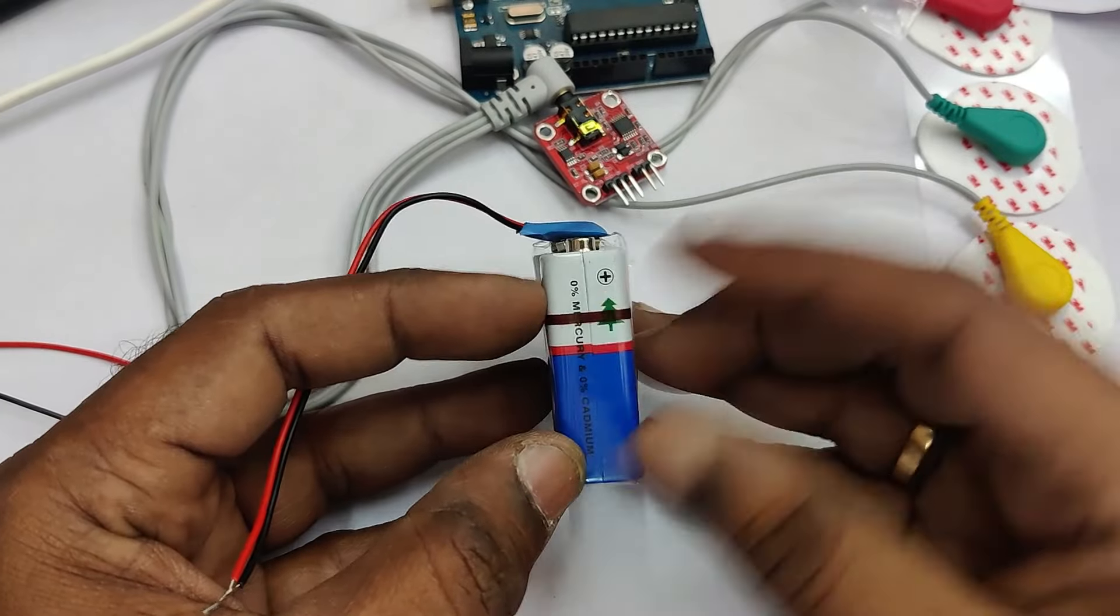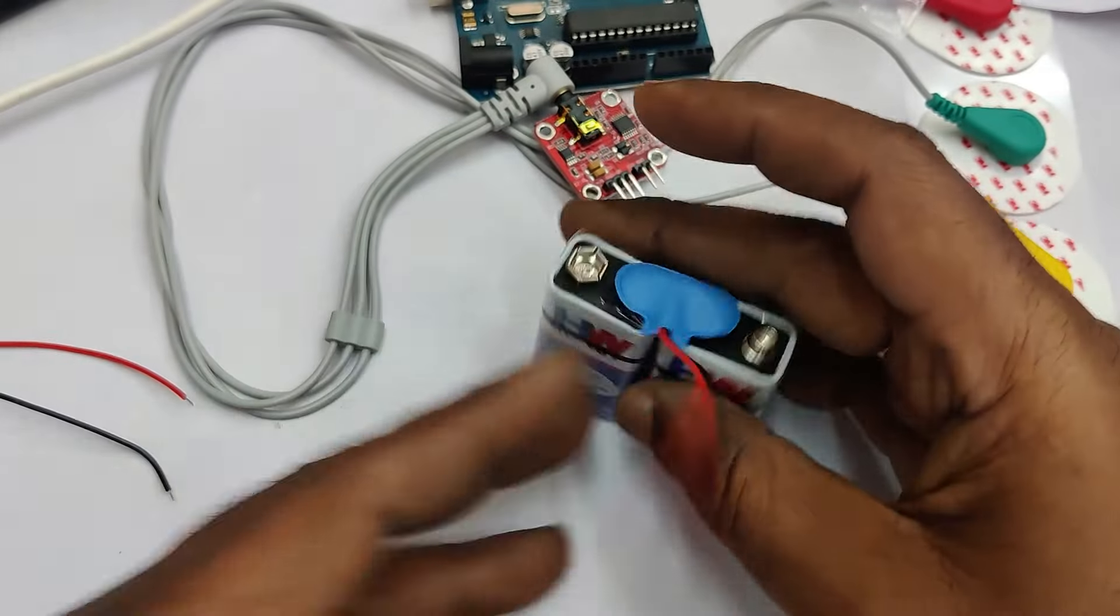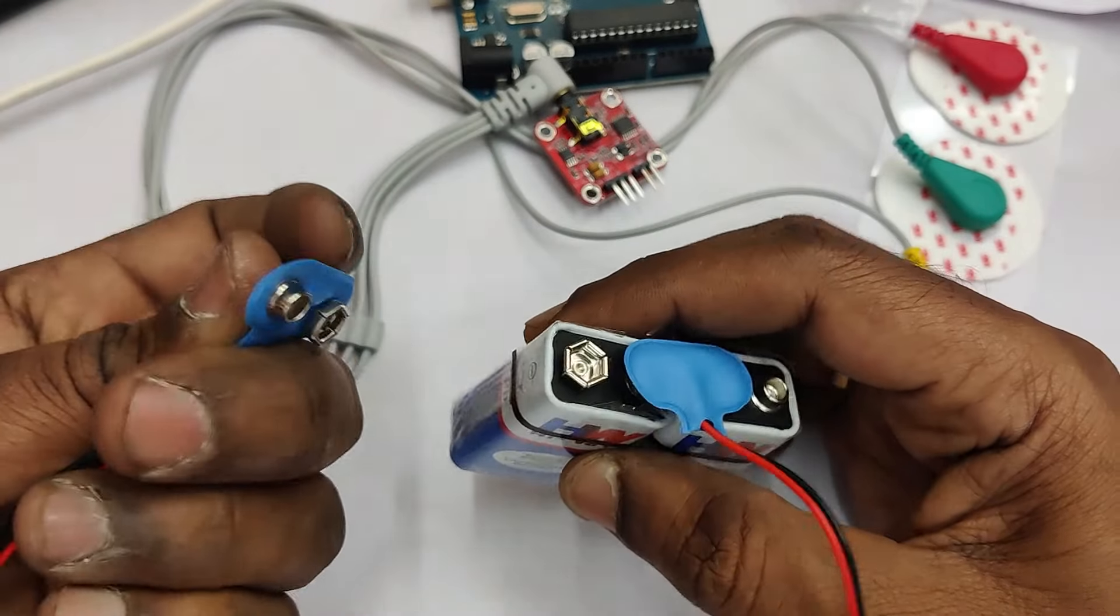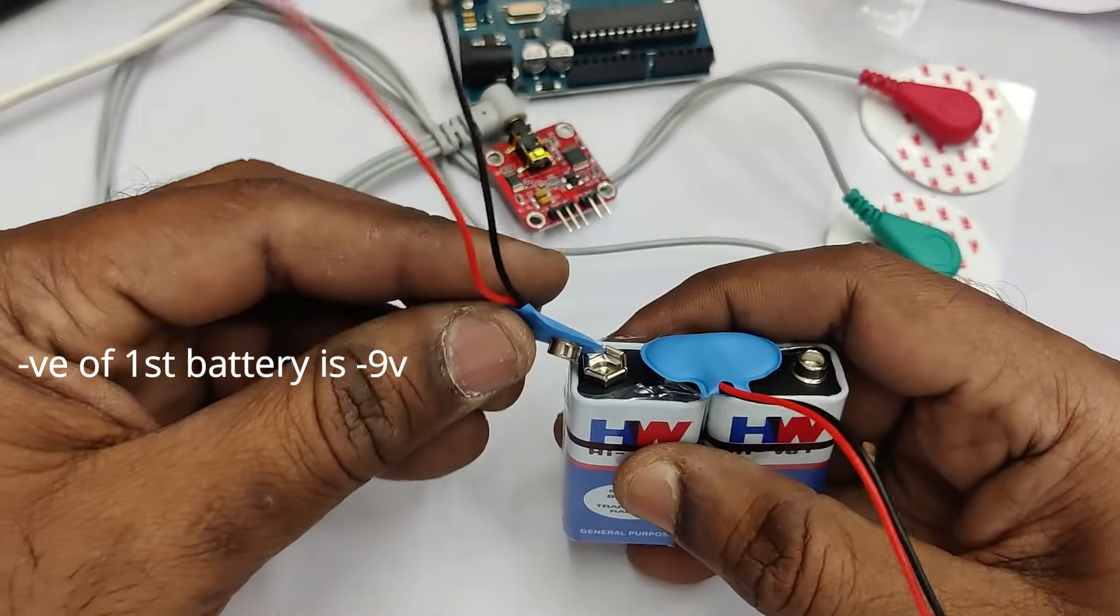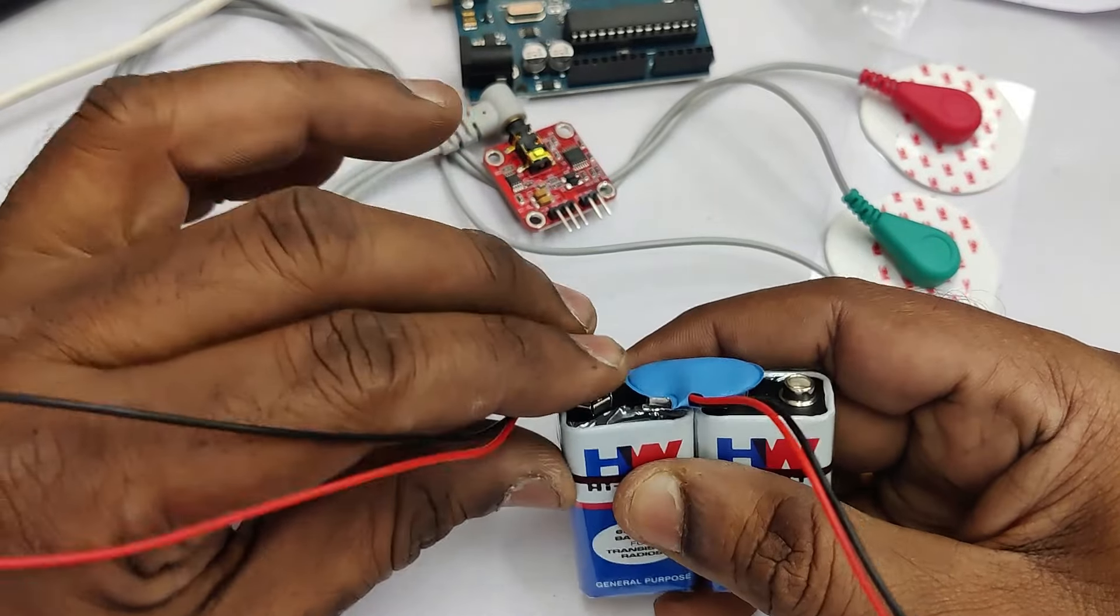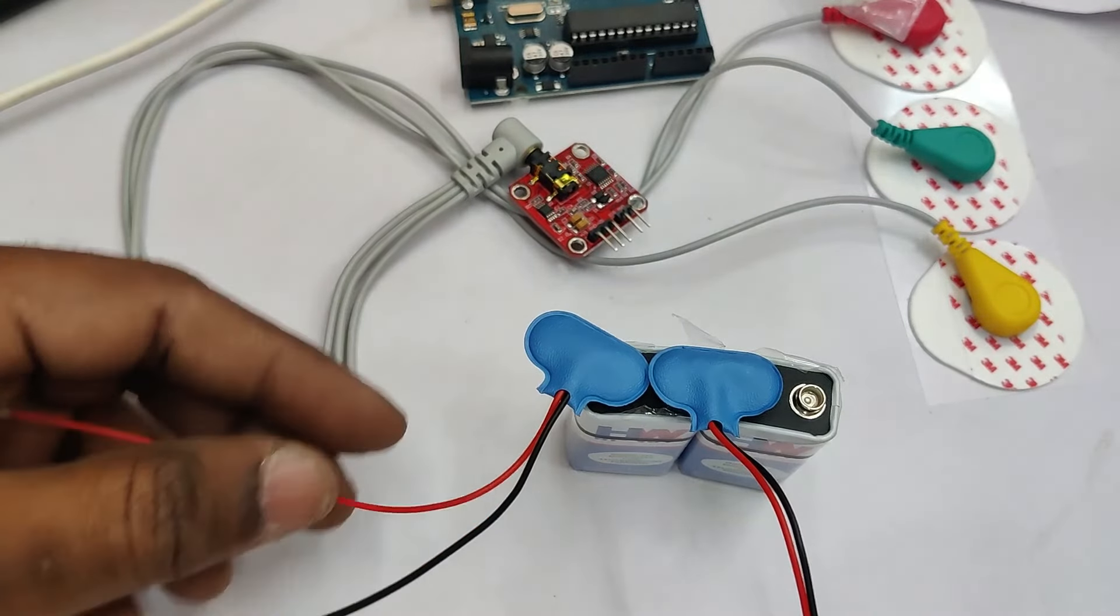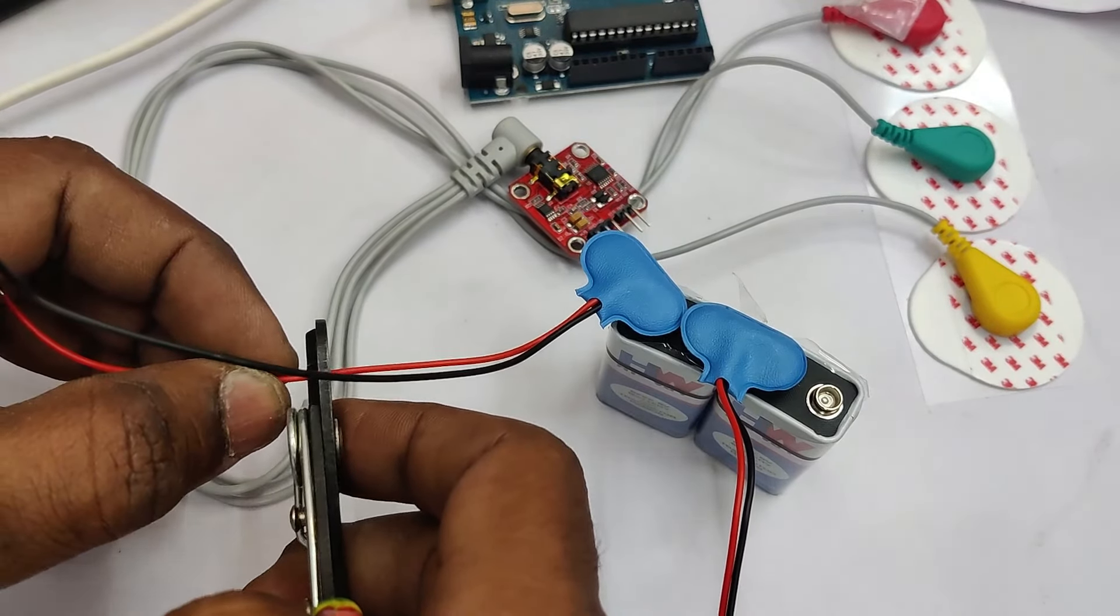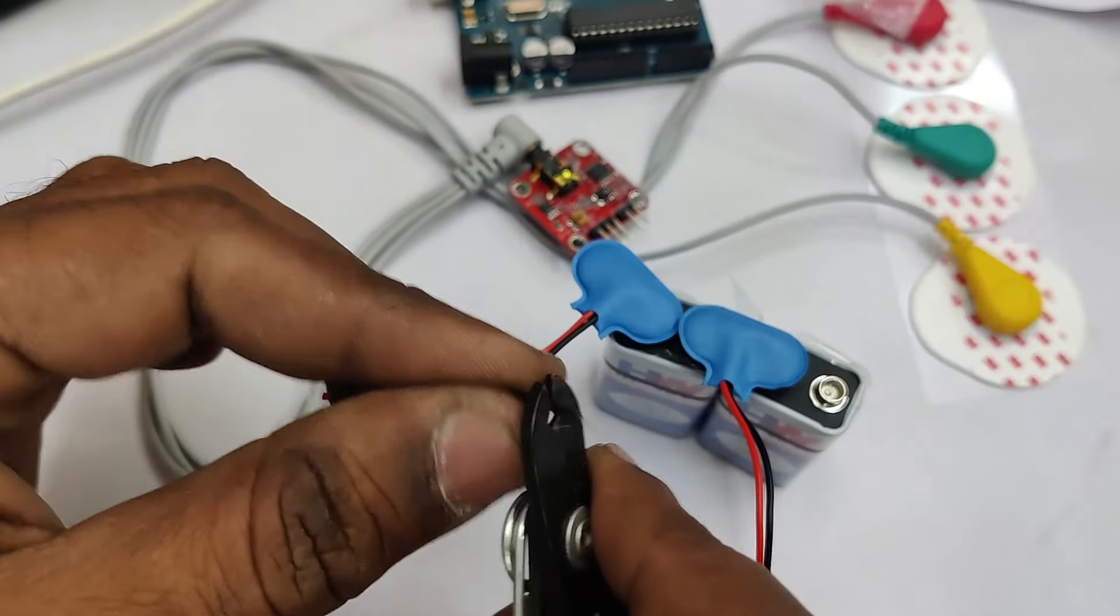Now one positive is left out and the negative is left out. Connect the negative of first battery which forms the minus nine volt. You can use the second tag like this. Now one wire is left out so we'll cut the red wire as you are going to make it as minus nine volt.